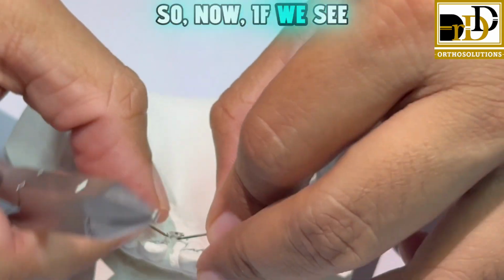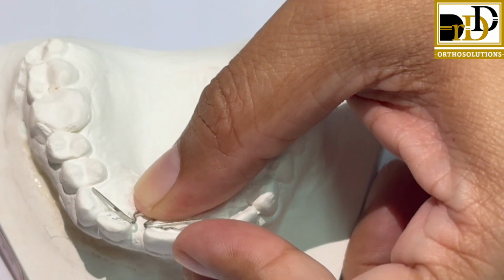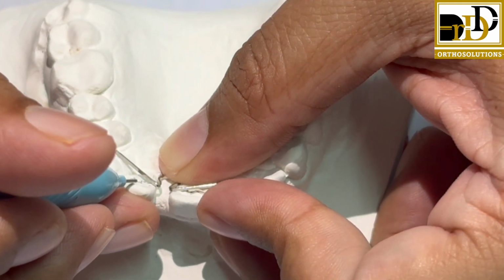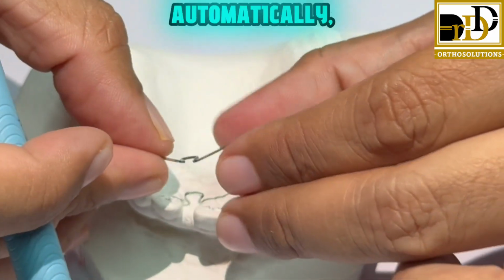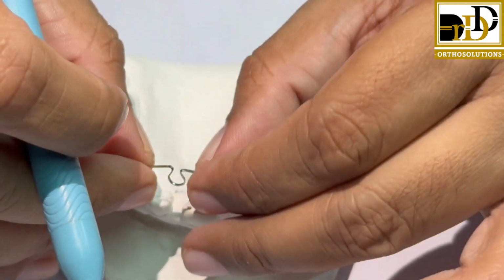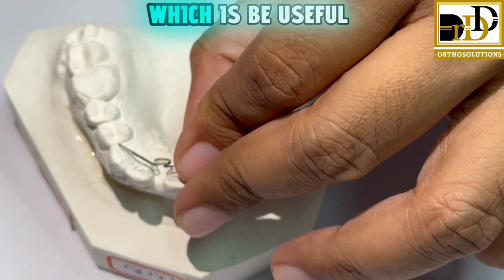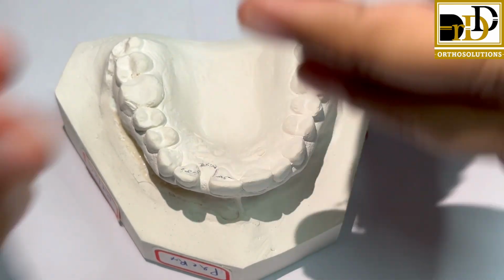So now if you see, it is having a distal tip. It is not straight, it is having a distal tip. So when we are engaging into the bracket, automatically it is going to have a space closure force which is going to get into the teeth. At the same time, the teeth are going to get the distal tip which is useful for the compensation to get a bodily space closure.